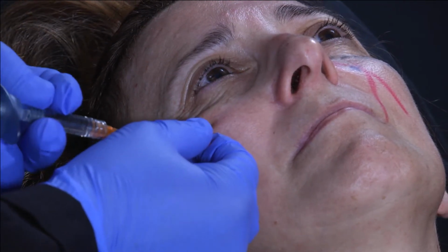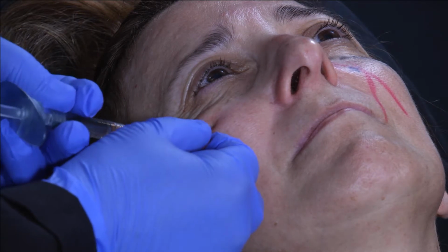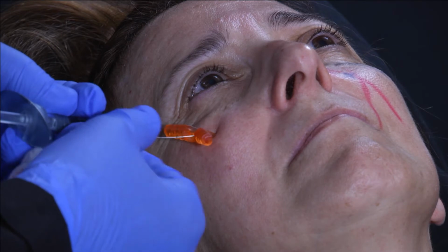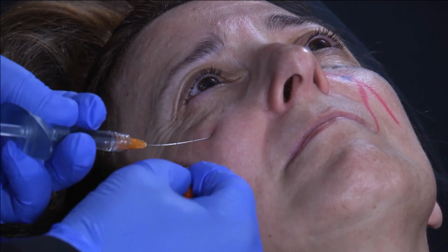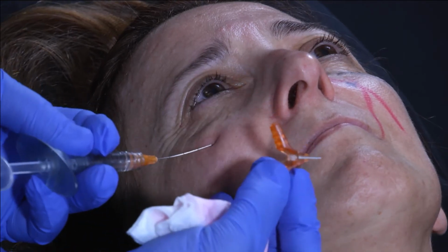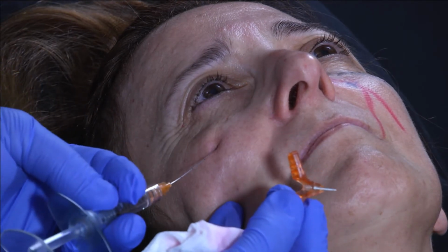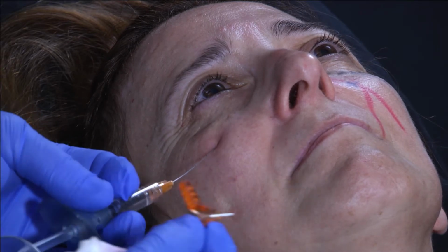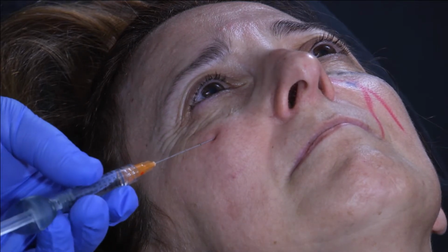Here you see, when I put my cannula here, you see that I'm on the bone, okay? And after, I remove the easy guide. And I'm on the bone. So here, that's very easy for me to slide on the bone and not to make pain to my patient.